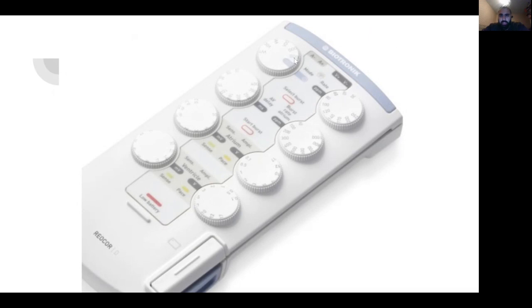This is DDD and this is DOO. They look very similar, and you need to be careful. These are the two that people sometimes mix up. And if you see DOO on the ward, you need to ask questions. So here you'll set the desired rate. If you want the rate to be 80, you'll set it there.